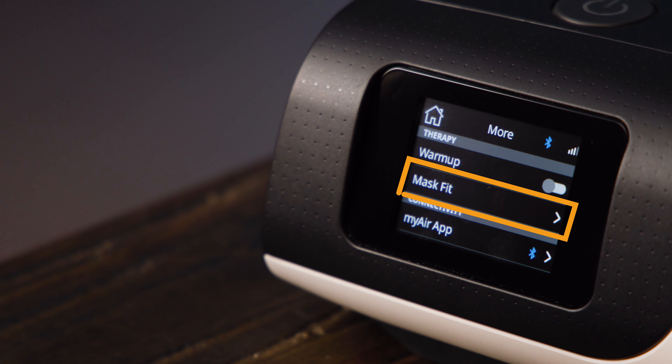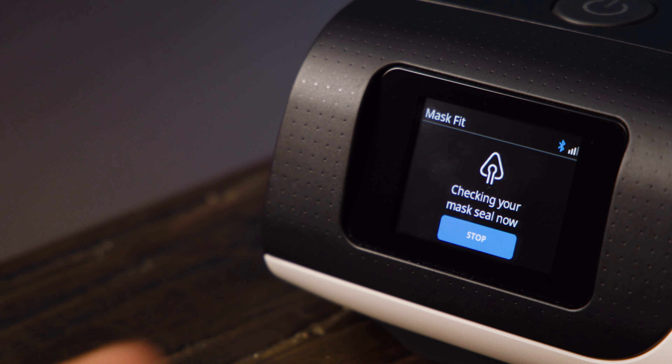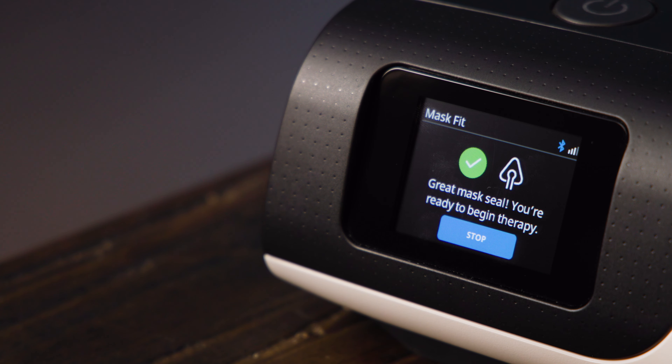Under this is Mask Fit, which runs a test to make sure that your mask is not leaking air. To run this, put on the mask and hit start. If the seal is good, you'll get a green tick. If there are leaks, you'll get an amber exclamation mark and should adjust your mask tightness until you get that green tick. Once you get a green tick, hit stop to end the test.